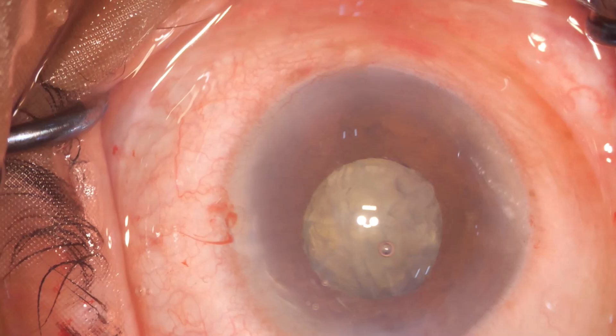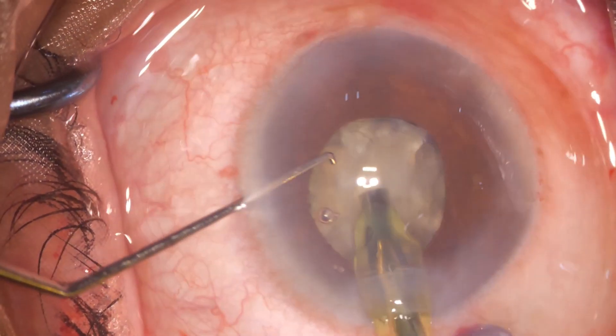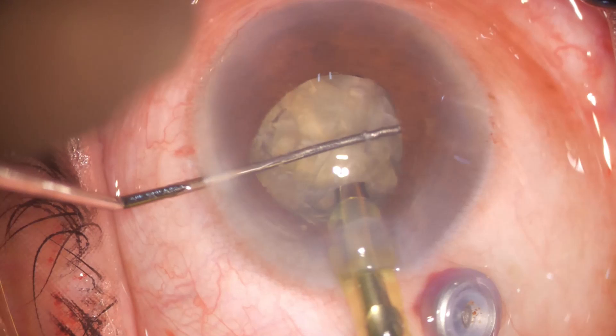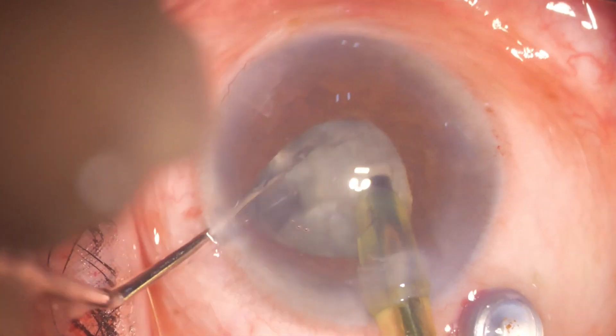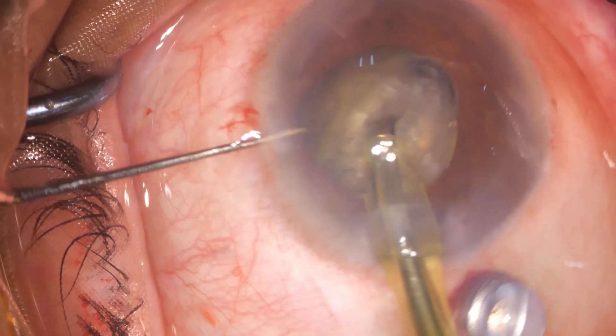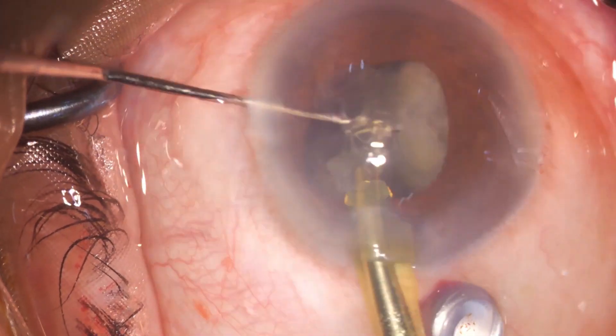One has to be very careful to coat the endothelium from time to time with viscoelastic. It was quite a struggle to get all the pieces out while being very careful to protect the endothelium. Also, the posterior capsule is not too far.